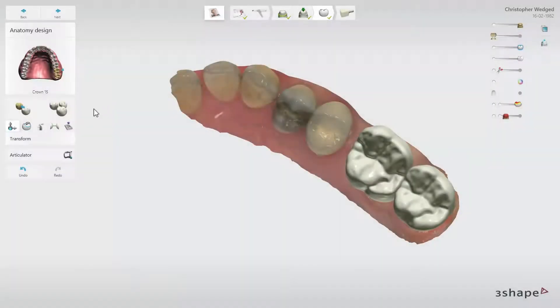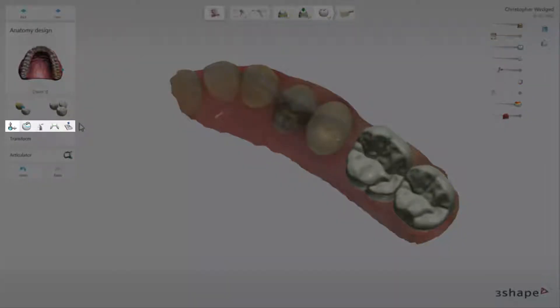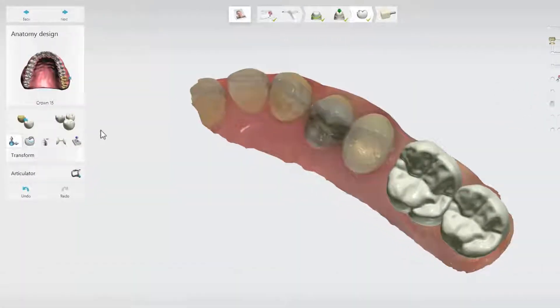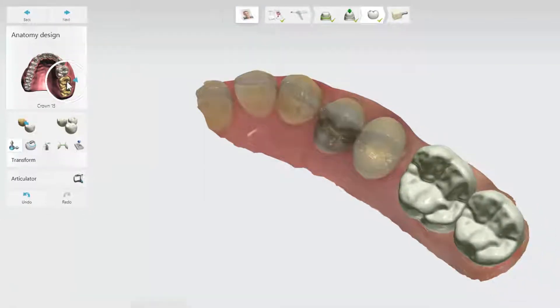If needed, you can also use the other available tools to adjust the design. The tooth that you work on is marked in the tooth selector. To change tooth, click either on the icon in the tooth selector or on the tooth design itself.